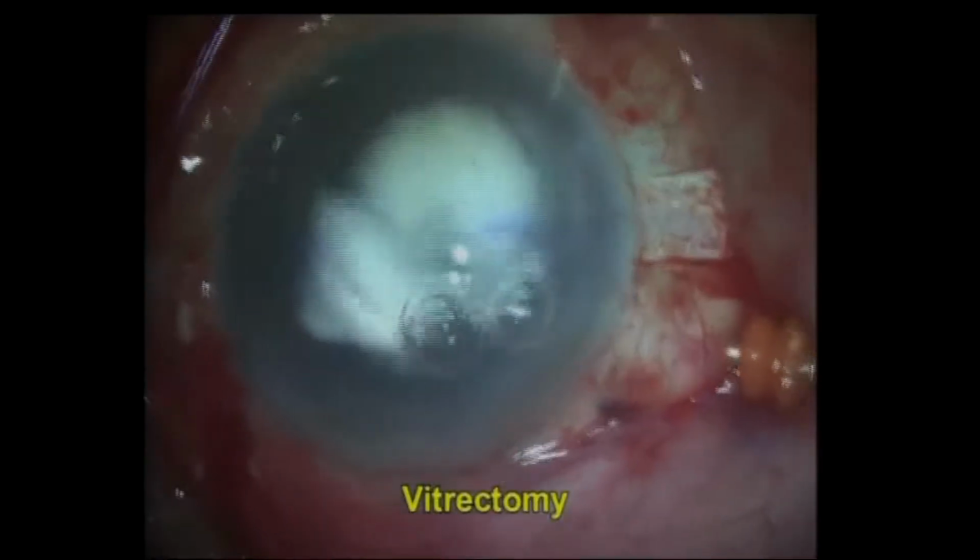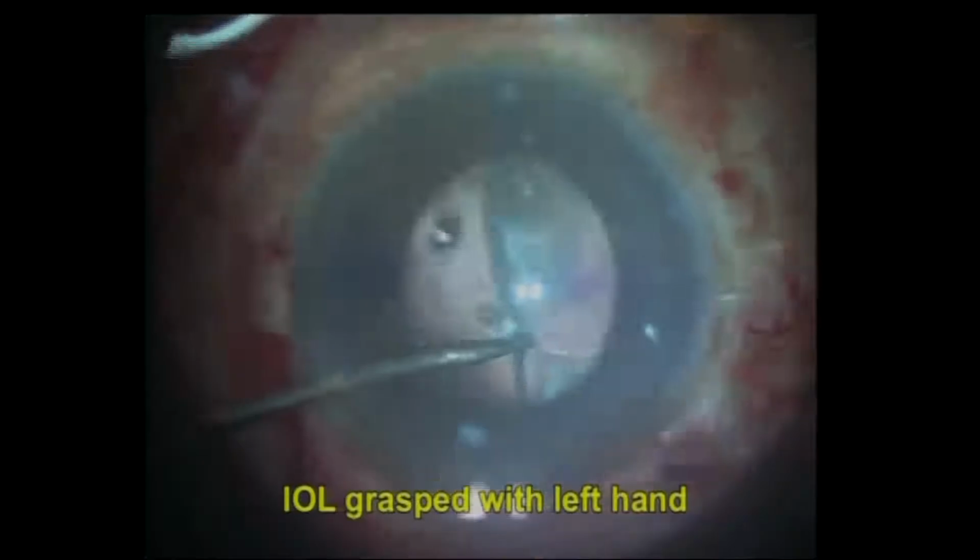I'm using triamcinolone to remove any vitreous in the anterior chamber, doing a posterior vitrectomy as well, going ahead and removing all the vitreous around the intraocular lens. Once this is done, I'm using an ECAL technique, that is an extrusion cannula assisted levitation.